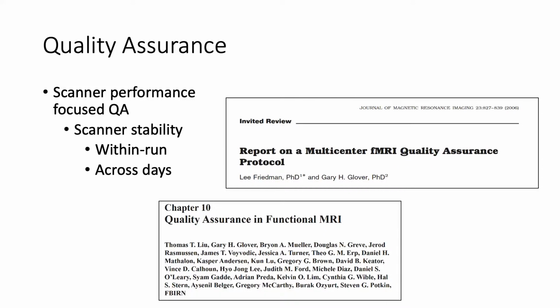Like I said, the quality assurance. There was a big multi-site study, including people from here, from San Diego, that were part of this, is really to do a multi-site MRI imaging center to see how we can combine data from different scanners and really create a large data set that experimenters can draw from. And to have that data set, you really need your scanners working properly, the signal being stable across scanners, and developing new quality assurance practices and guidelines to help make that work. It's really important for that multi-site, but also even for single studies.